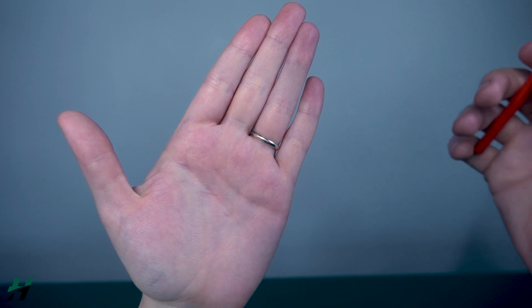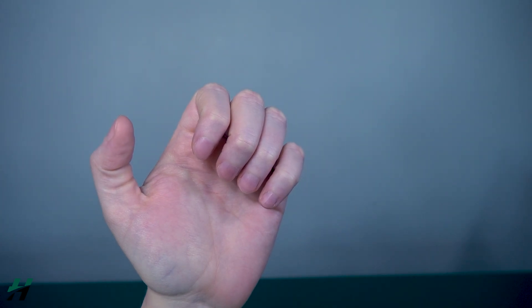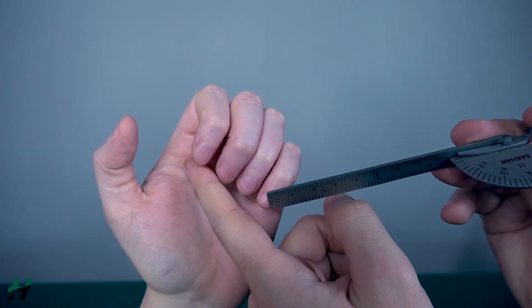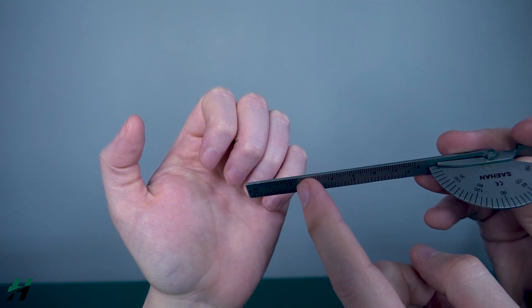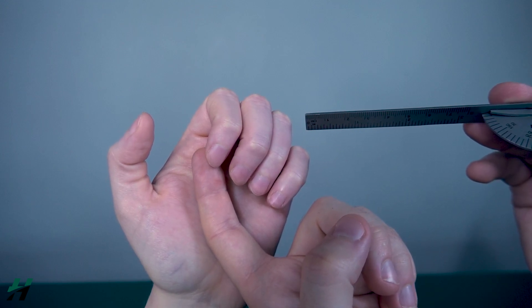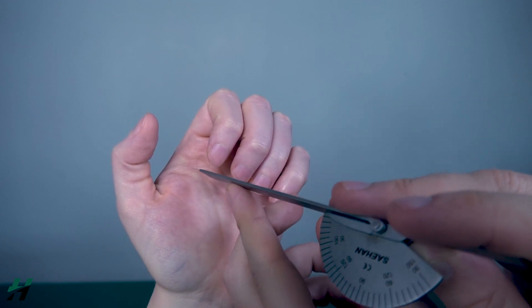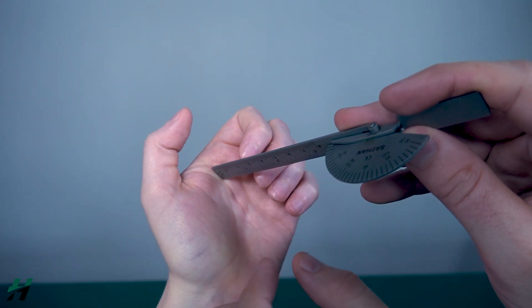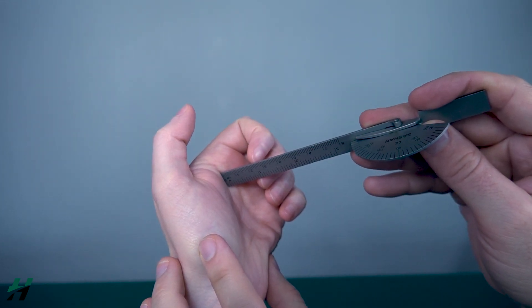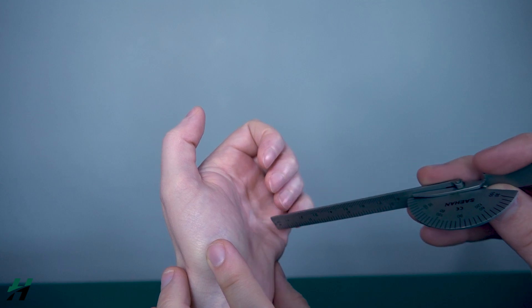Rachel, ball your hand up but pretend you cannot go all the way with flexion. To make this measurement, wedge the distal end of the goniometer into her palmar crease and place the measurement tool against the fingernail or finger pad — just be consistent, because inconsistency will give you different measurements. Right here, measuring up with the fingernail, we're looking at about 20 to 25 millimeters. You then do the same for all fingers.